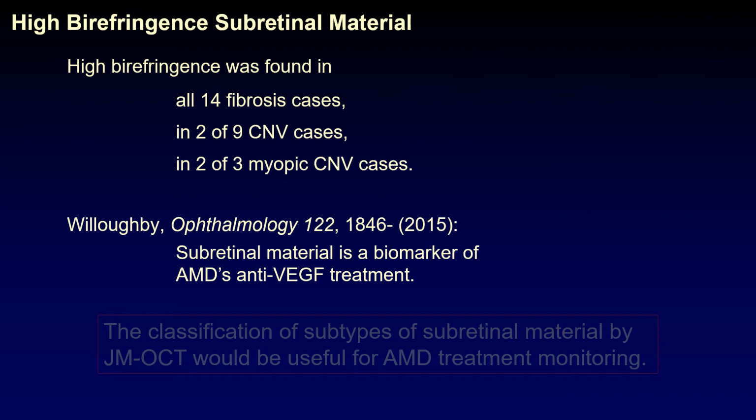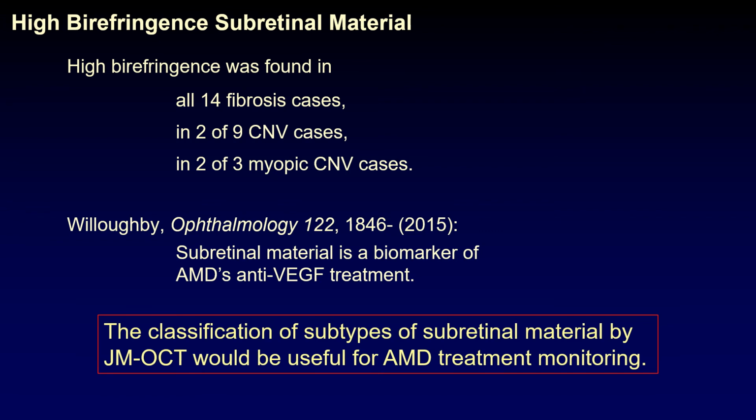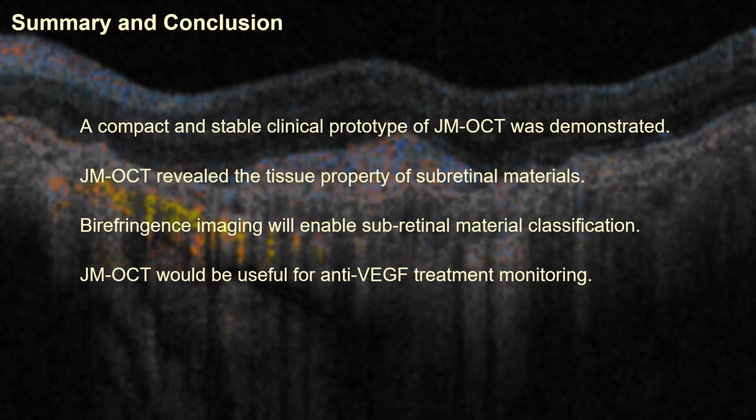Willoughby recently pointed out that the subretinal material can be a biomarker of AMD's anti-VEGF treatment. So, the classification of subtypes of subretinal material by using JM-OCT's birefringence measurement would be a useful tool for AMD treatment monitoring. Let me conclude my talk.